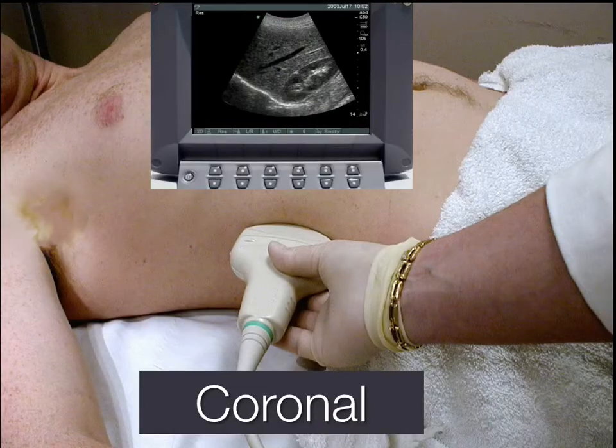This is where people get confused. Coronal. Coronal, like its sagittal cousin, you aim the indicator towards the patient's head, and I say it's the sagittal cousin because it's also a longitudinal plane of the body. But now this is the skin line being lateral, and as we go deeper into the body, the sound is going medially, and that's what confuses people right there.